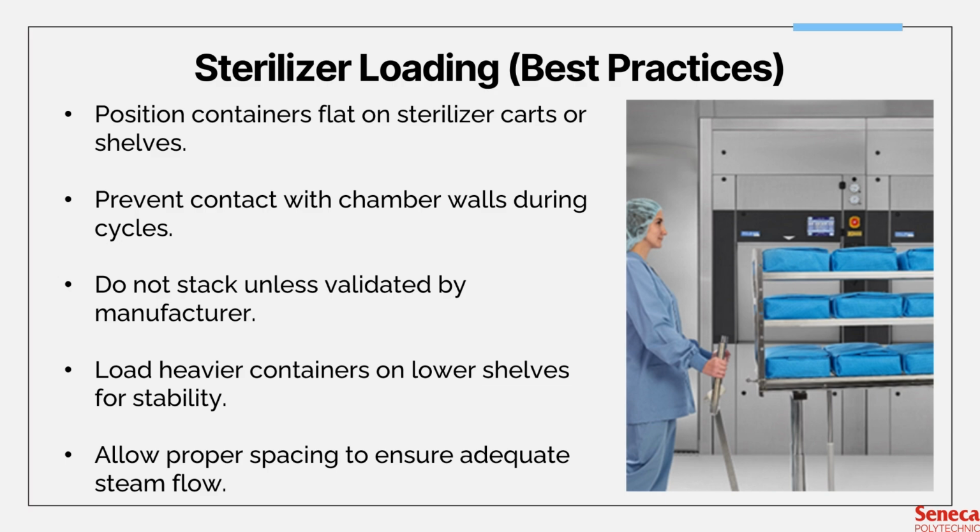For those of you who didn't know this, some hospitals actually allow stacking of rigid containers for efficiency, but a lot of hospitals do not practice this.